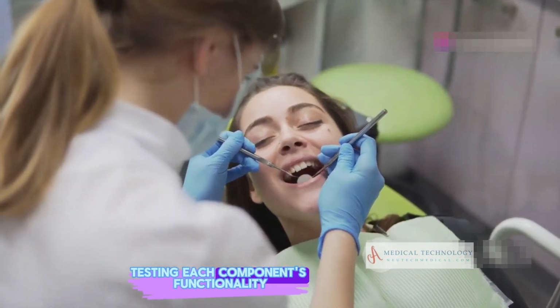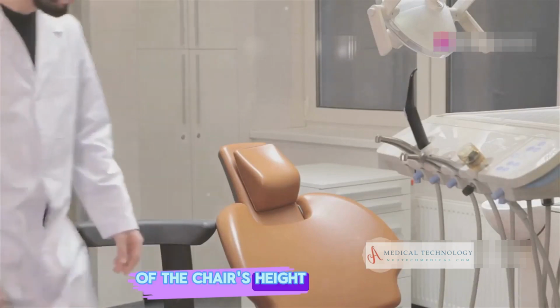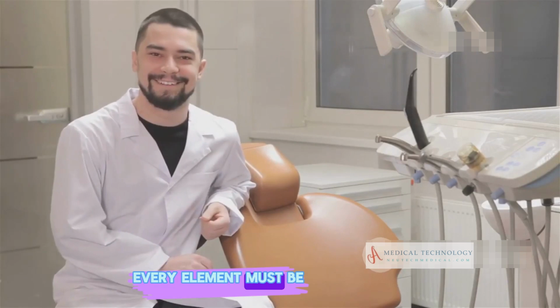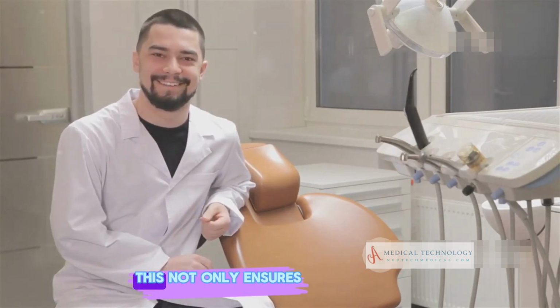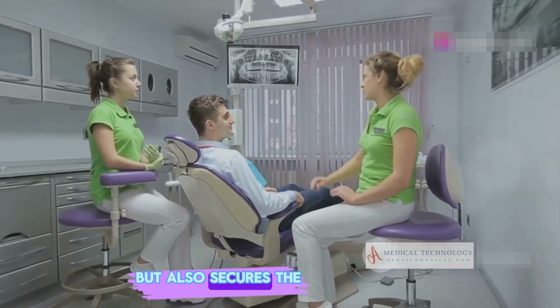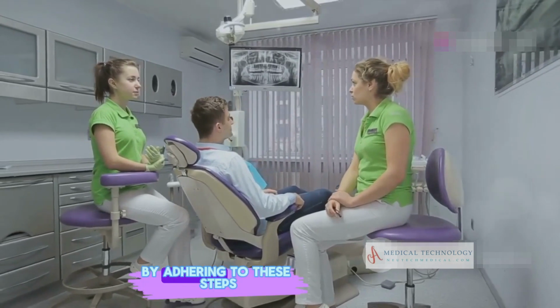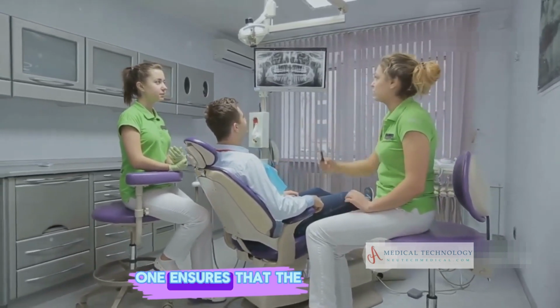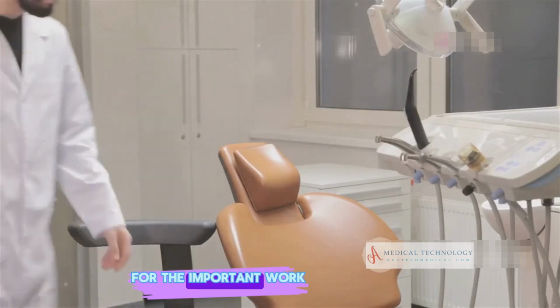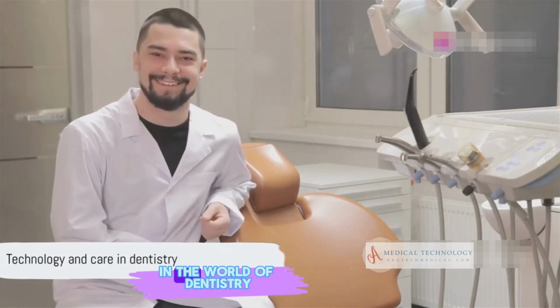Finally, testing each component's functionality is critical. From the smooth adjustment of the chair's height to the efficient operation of the air and water systems, every element must be in top working condition. This not only ensures the chair's readiness for dental procedures, but also secures the safety and comfort of patients and dental staff alike. By adhering to these steps, one ensures that the dental chair is not just installed, but perfectly primed for the important work it's meant to support. This is how technology meets care in the world of dentistry.